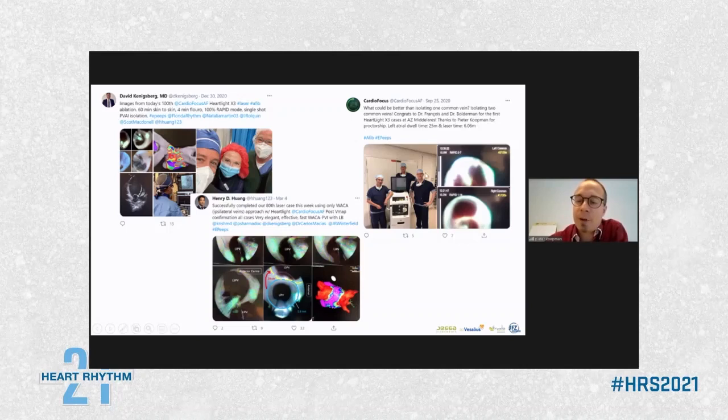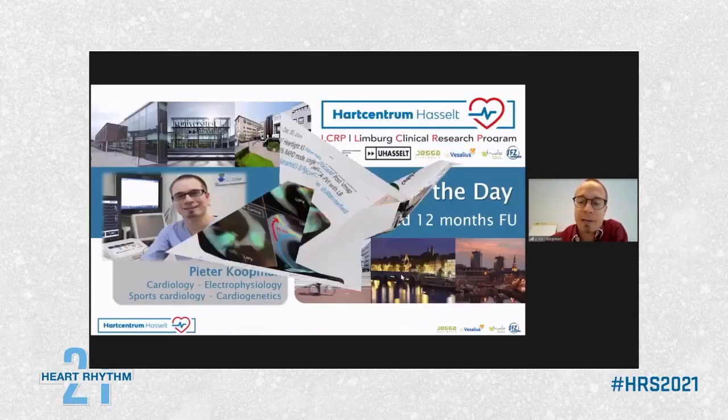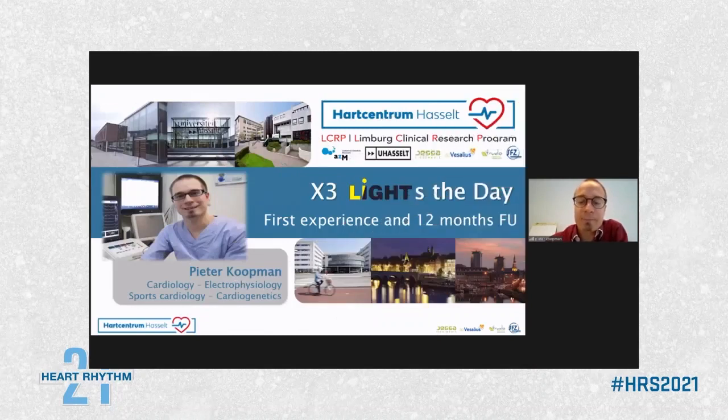And this is an interesting story. I did a proctoring case in a hospital in Belgium, and we had 2 very large common ostia. It would have been a disaster to ablate those with the cryo balloon. But with the laser balloon, we were able to occlude both of the ostia. We needed 6 minutes of lasering time in total, 25 minutes of left atrial dwelling time, and a 32-minute procedure. And I can tell you, this kind of procedure really lightens my day. I thank you very much.